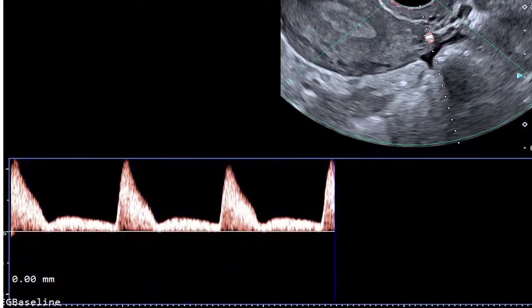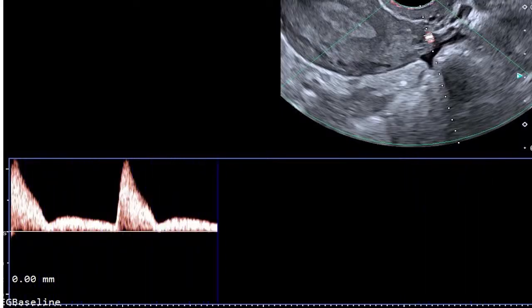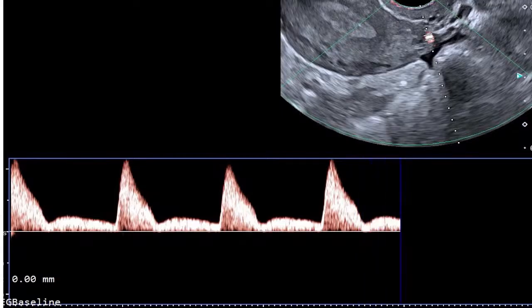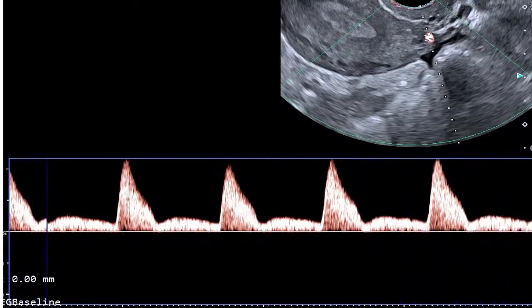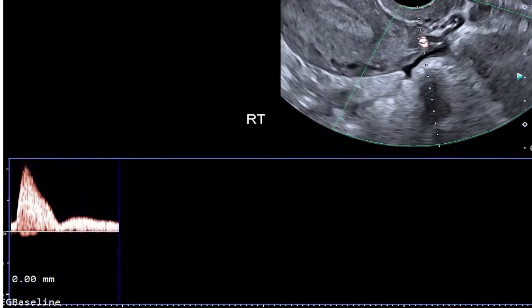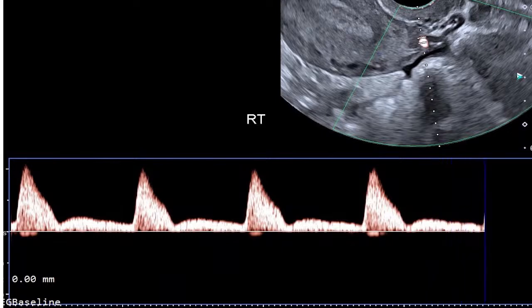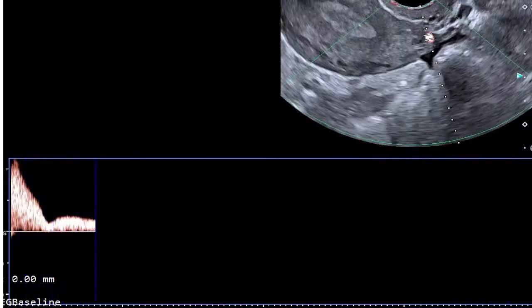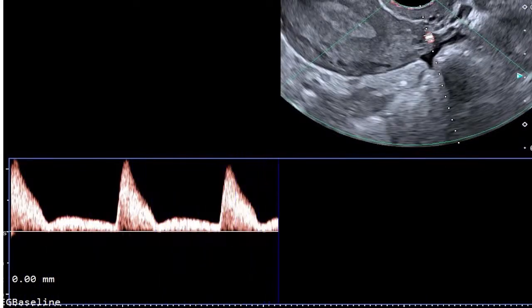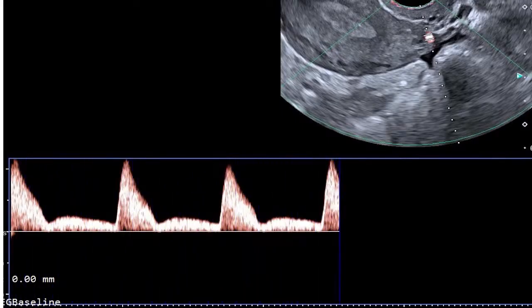I need you to be very patient with me on this one, so that we don't miss anything that is critical here. I hope it's going to make sense. The fundamental thing that I want you to grasp before I build this concept is that we are entering a new era of reproductive medicine. One way ultrasound allows us to assess the environment for implantation before pregnancy begins. So it's very, very critical. That's why I just brought this to you guys.